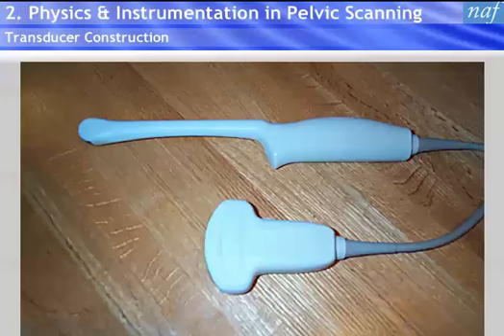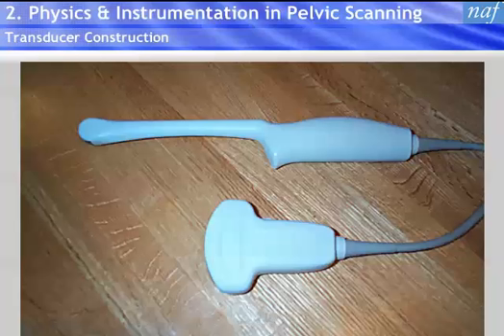The construction of the ultrasound probes is highly technical. They are very expensive. In many cases, probes that are broken cannot be repaired. Care should be taken to avoid dropping them, knocking them, or running over the cord.